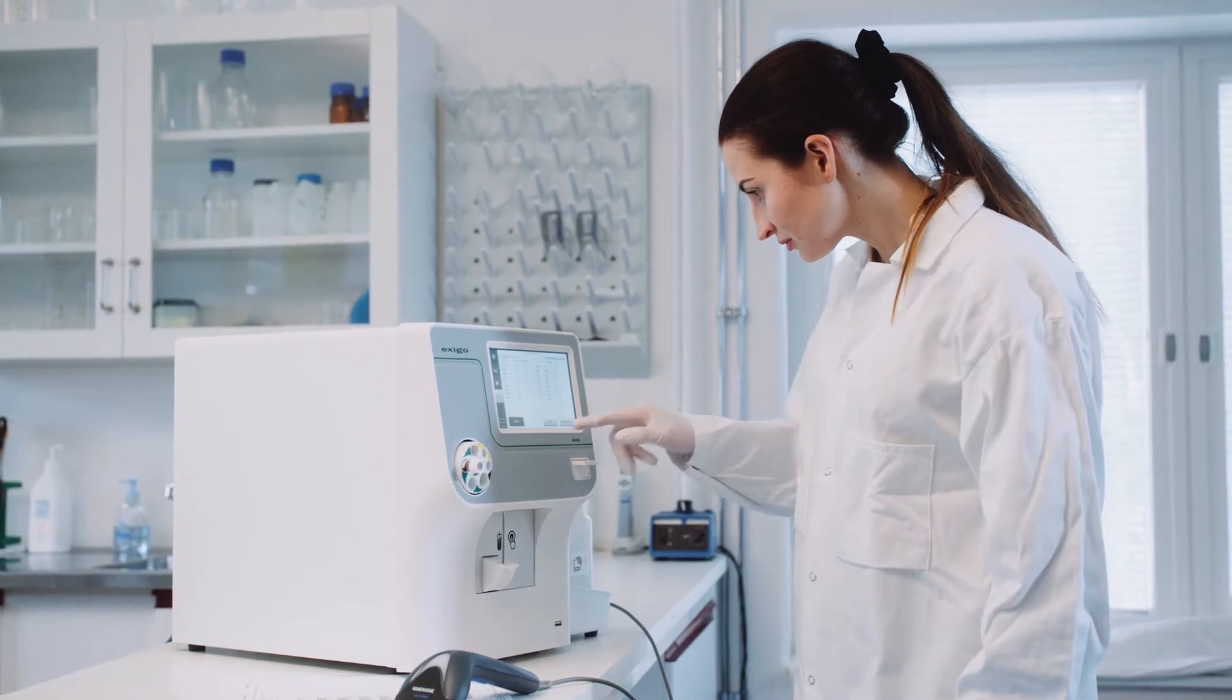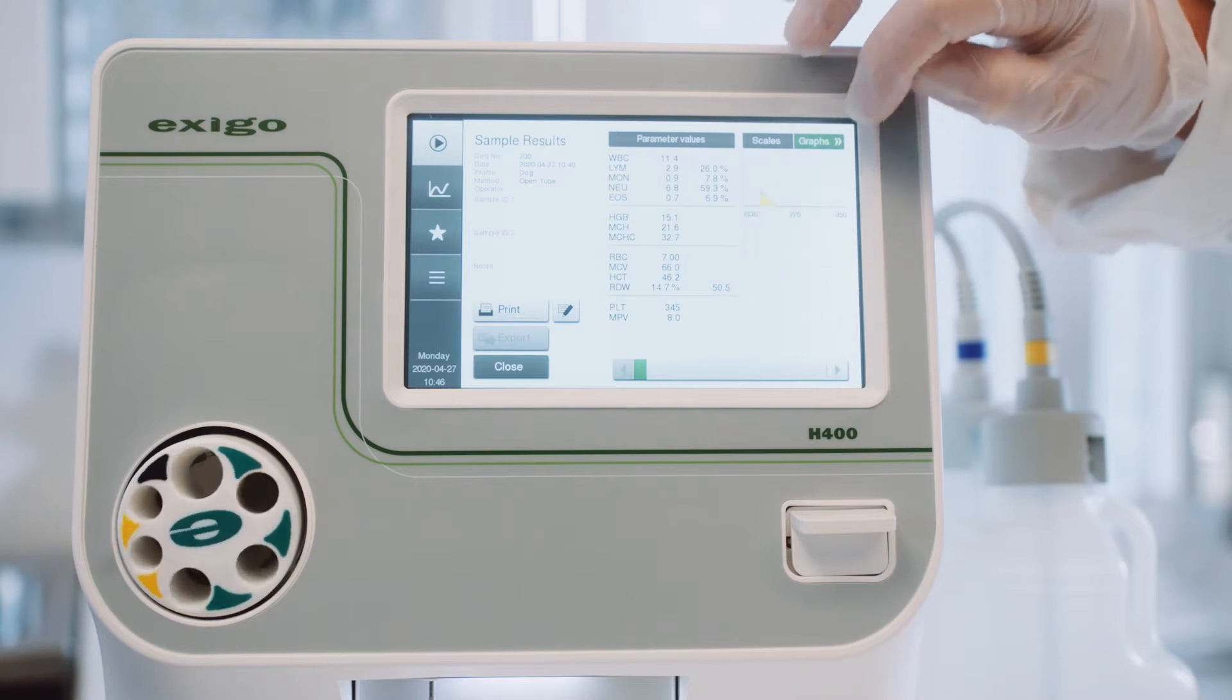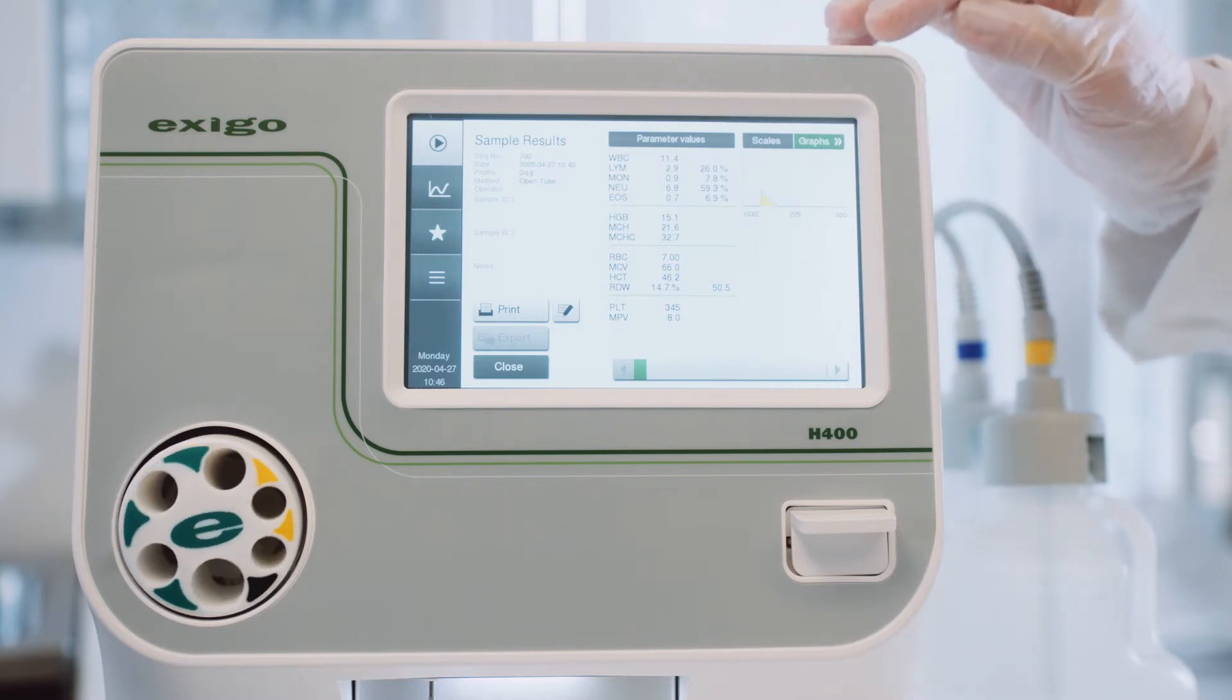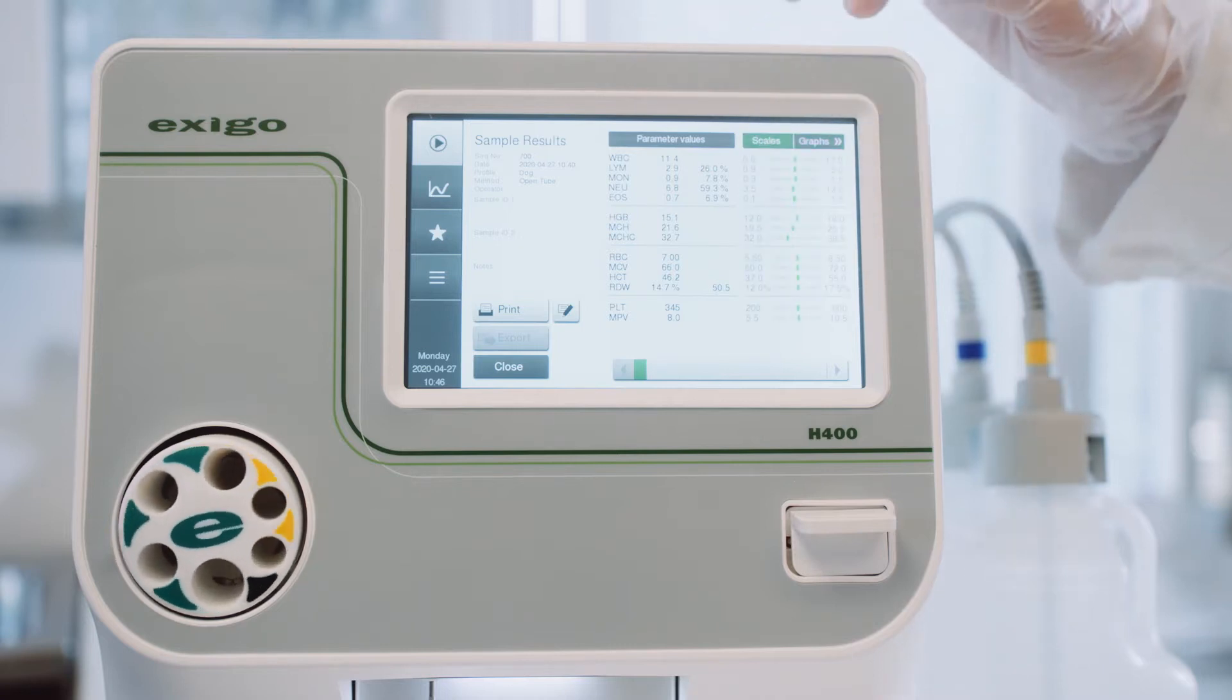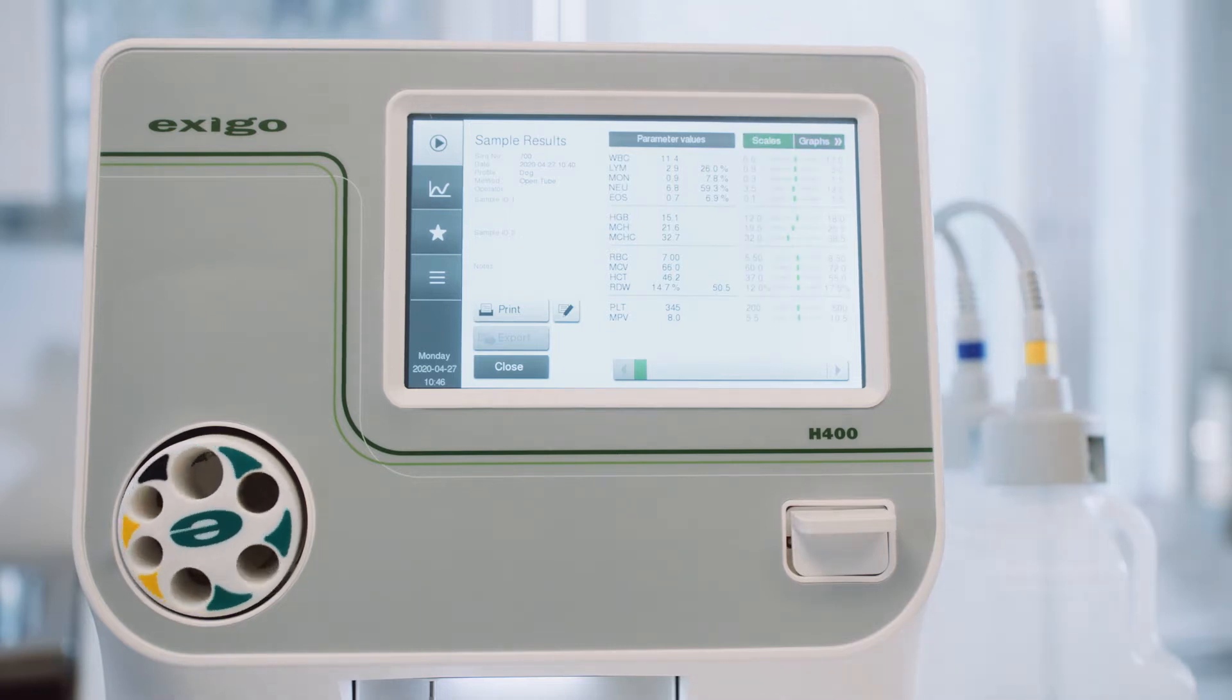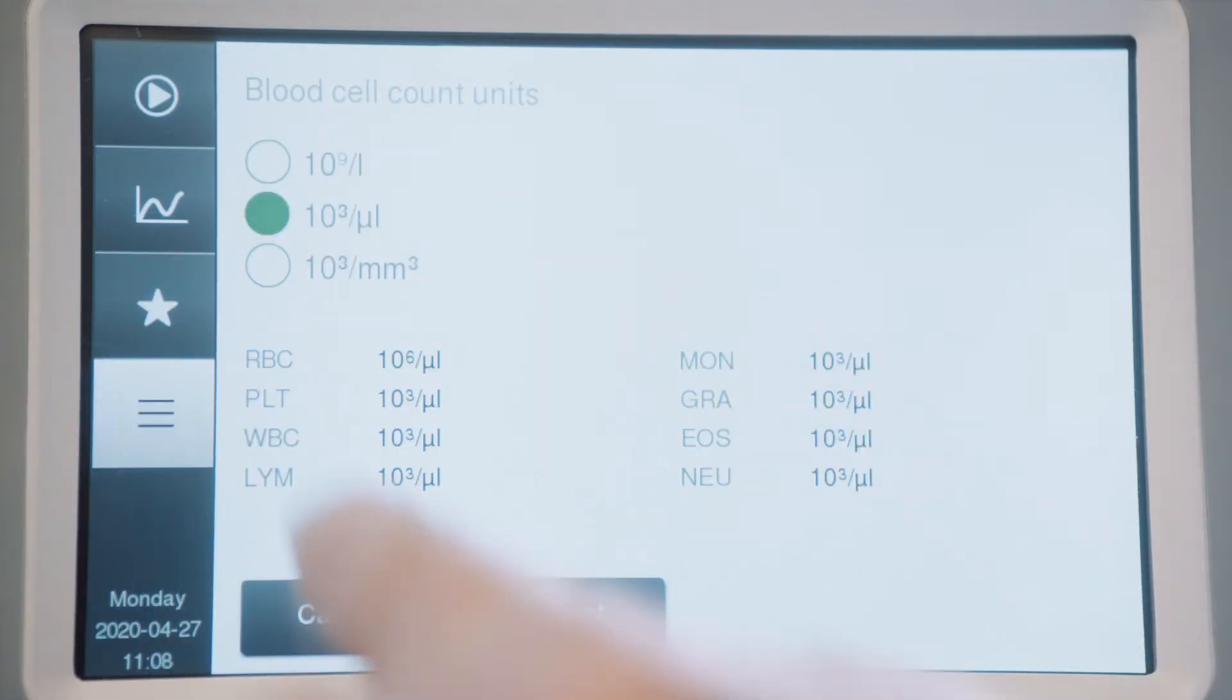Whatever the sampling method, you'll see the results on a full-color touchscreen. Exego H400 lets you decide how you view results. Choose between histogram or reference scale views. The units, parameters, scales, histograms, and orders they are presented in are all settable.